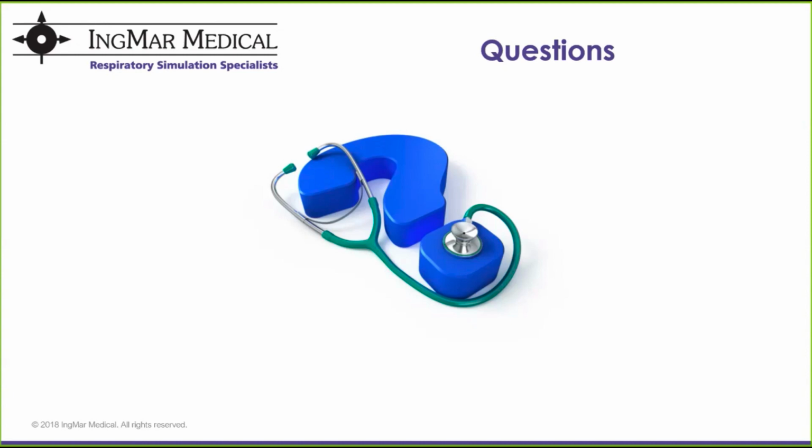In fact, ARDS and COPD are both standard disease states that are included with the purchase of the system. So you can actually run those from our library and adjust the severity. But yes, virtually any type of patient. And if you're curious about other specific types of disease states, please let us know, and we can talk to you about how that can be accomplished.